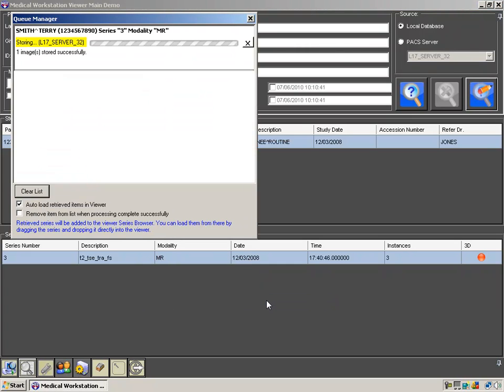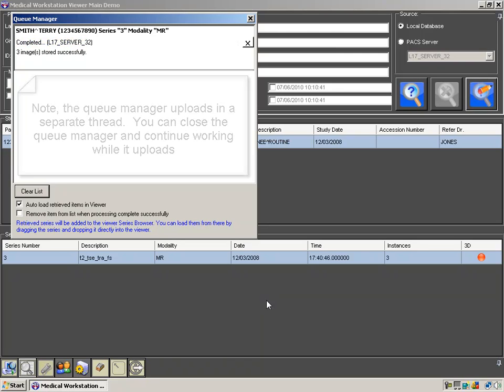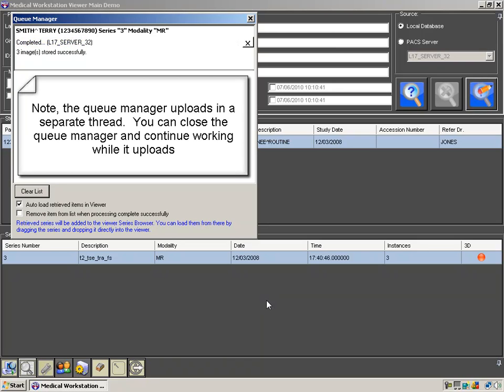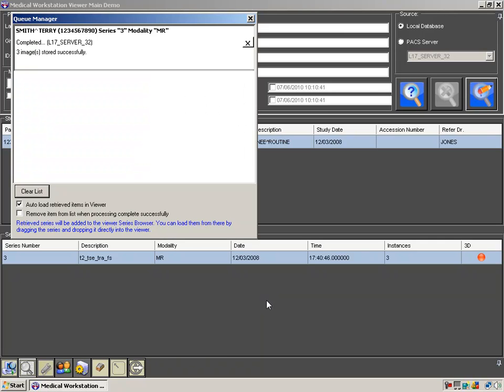You'll see in the queue manager we are now storing to the L17 server 32 PACS. Once you see the status change to completed, you have successfully stored the data set to the remote server.